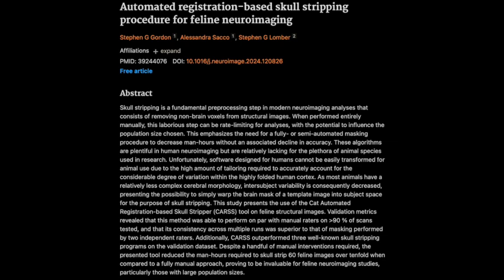So traditionally, how has the skull stripping been done? Has it always been a meticulous manual process? For a long time, it was primarily a manual process. Researchers would painstakingly trace the outline of the brain on countless MRI slices, which, as you can imagine, was incredibly time-consuming and prone to human error. I can only imagine the eye strain. Sounds like a recipe for caffeine overload.